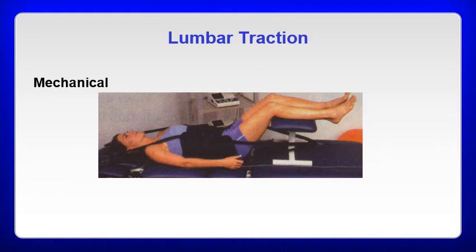When you're looking at traction and positioning, I'll talk more about timing and everything later. For the position you want to use for lumbar traction, we said for cervical traction you're going to be doing either supine or seated. You obviously can't really do a prone cervical traction. It's going to be kind of tough because they're not going to be able to be face down on the table.